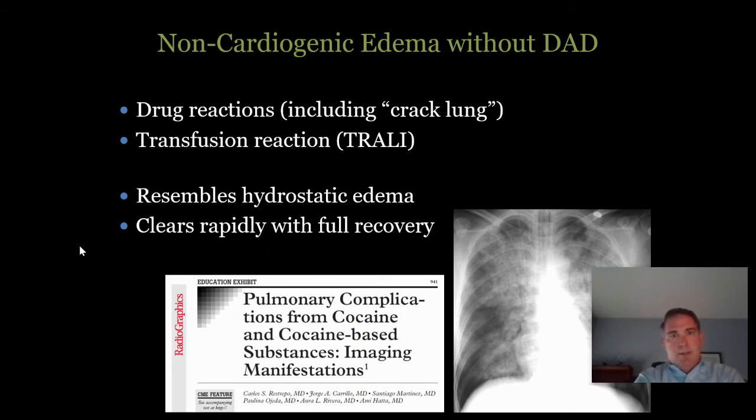If someone has a transfusion reaction that causes a cascade, if we confirm that the imaging, which looks like edema, could be a transfusion reaction, it creates a cascade of events where they have to pull any blood products that came from that donor, which sometimes get split into many different products. So it causes a little bit of a headache when we do confirm that suspicion. So be mindful of that.